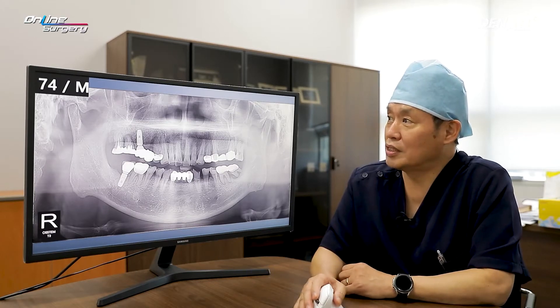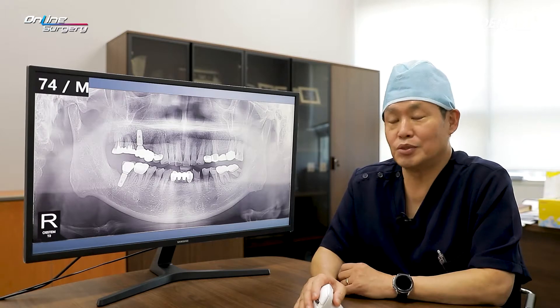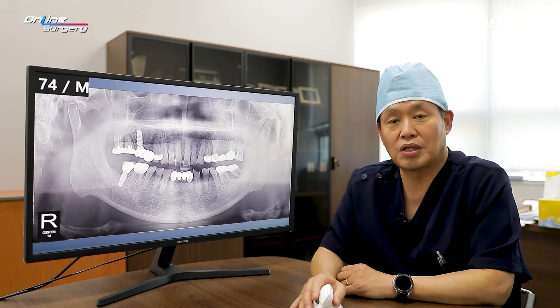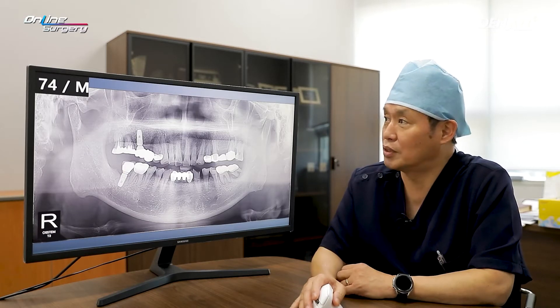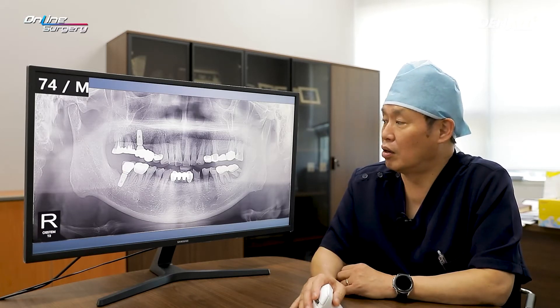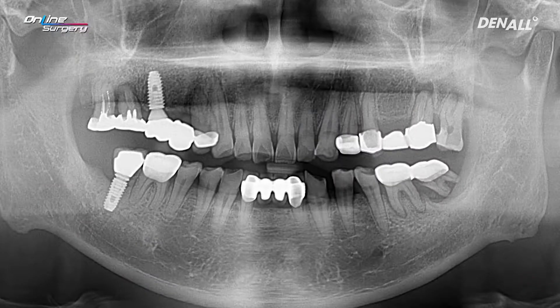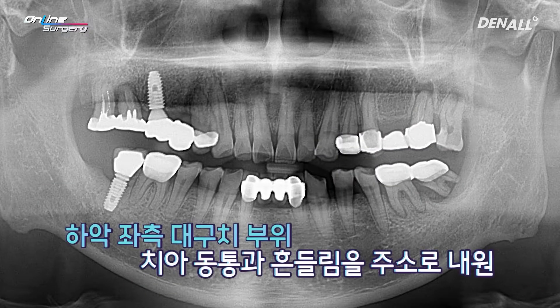We will look at the patient — a 74-year-old male patient with no special medical history. The patient did have acute cholecystitis, however it's not a big problem. The patient came in approximately in April with pain and mobility in the lower left molar teeth.